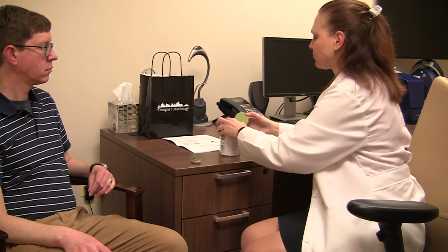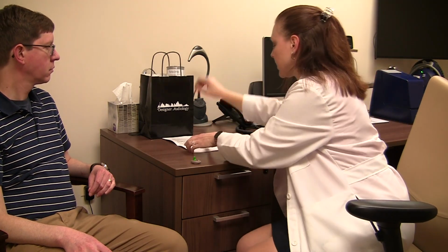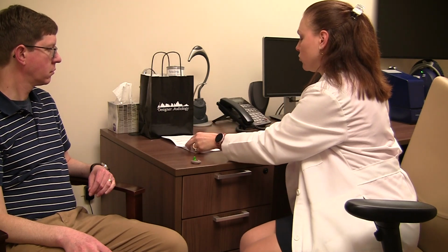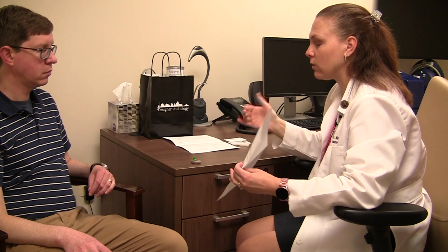All right. Good so far? All right. So I'm going to pause for a second. Everything I've just told you is written down on this piece of paper for you. So again, every day in the morning, soft dry toothbrush, just brush off the hearing aids. Every night, you're going to put the hearing aid in that little dryer and put the lid on, and that's going to dry everything out.